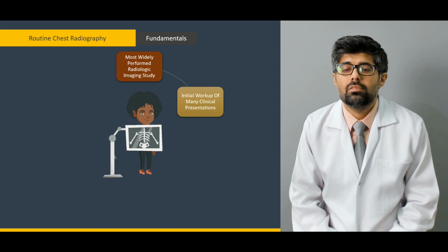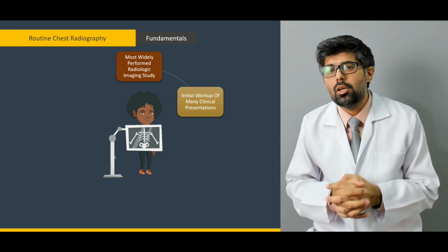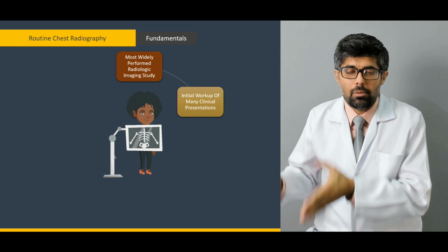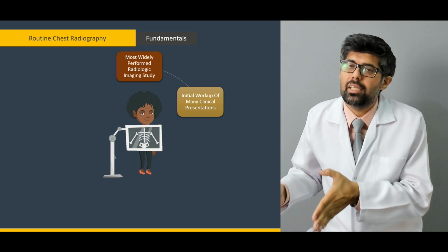Next, it is also used as the initial workup for many of the clinical presentations. Now, many patients present with certain symptoms and patterns, and most of these require certain tests which are called the baseline tests.